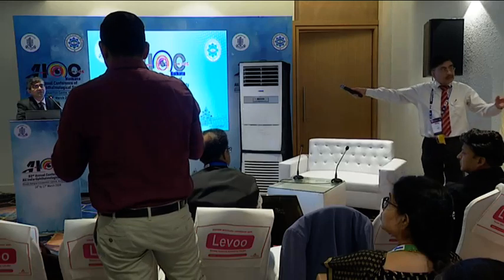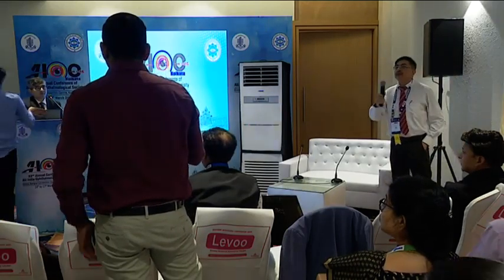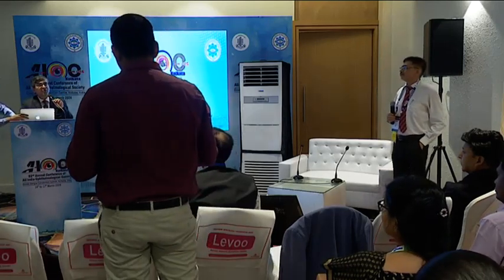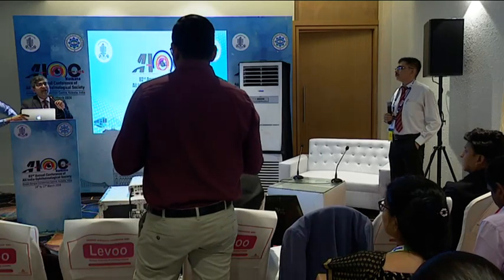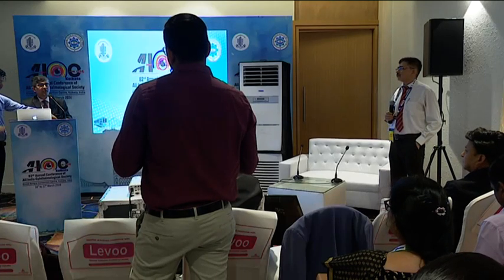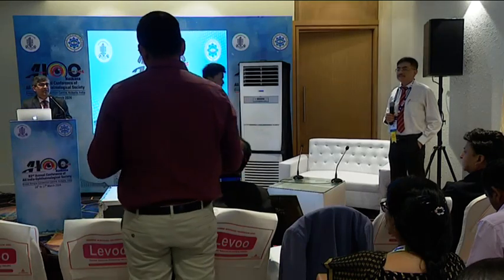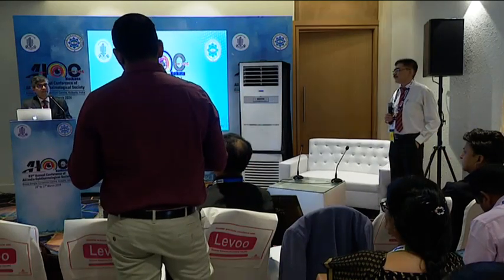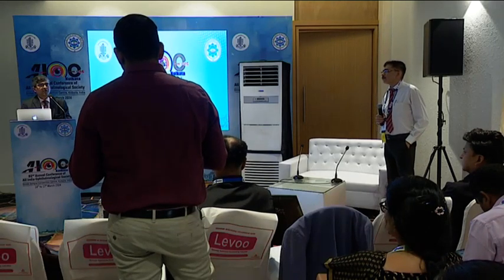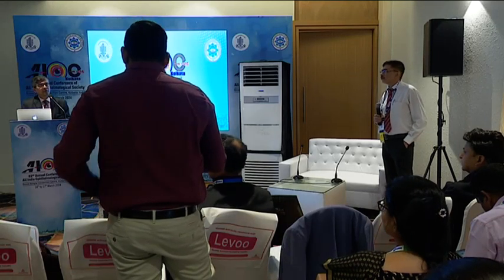So you have taken the tissue sample. What is the care you need to take before sending it to the pathologist? Make sure you communicate with your pathologist prior that you are taking a biopsy for a particular case. Ideally, the pathologist should be in your operation theater. As soon as you take it, within 30 minutes, it should be sent for cytology or cell block, depending on what you are taking. If it is a vitreous biopsy or any aspirate, usually they prepare a cell block. If it is a tissue specimen like retina or the choroid, you can fix in formalin and they can do a histopathological section.